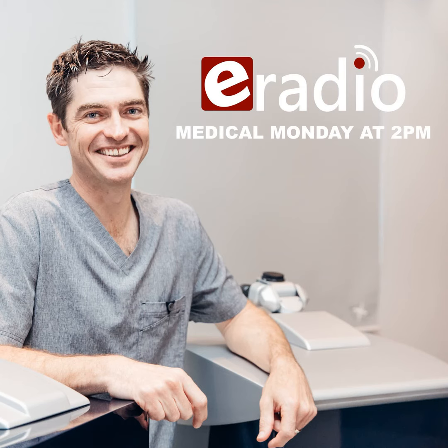And as you mentioned earlier, some people are a little bit frightened about having a flap, or if they play contact sports like rugby or boxing or wrestling, you don't want that risk or chance of potentially dislodging or getting a fingernail underneath the edge of a flap. Although with modern day femtosecond lasers, because of the construction of the flap, they are really, really tightly sealed. We still prefer in those instances not to take a chance, and we do a surface procedure instead.